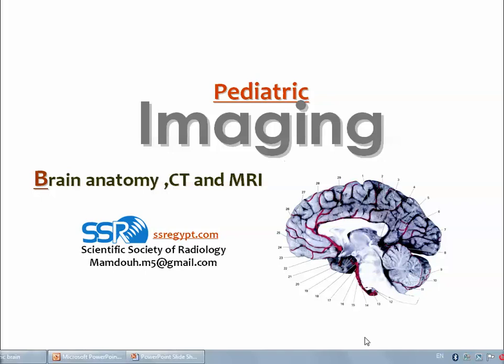or 4 lectures, starting by the normal brain anatomy by CT and MRI. Then we'll talk about hydrocephalus, then imaging of the pediatric brain tumors, then imaging of the cortical formation and the neuronal migration disorders, then imaging of pediatric CNS infections. And we may have time to discuss the white matter imaging, and let us start by this, and we'll talk after that about the topics I have mentioned.